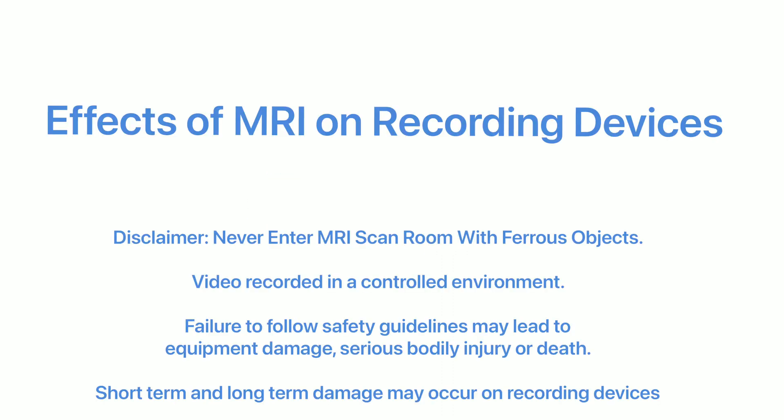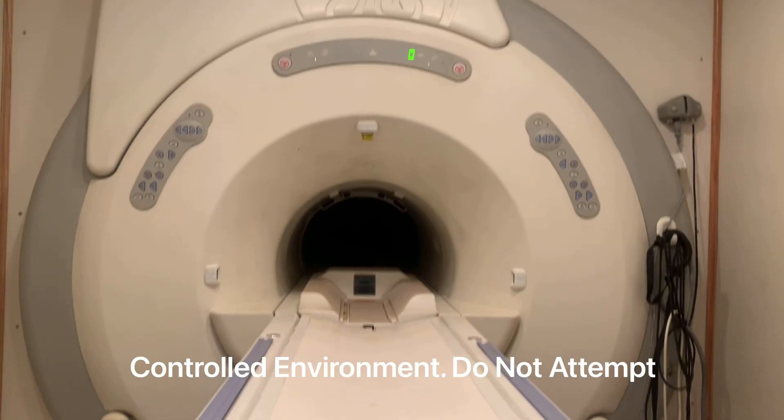This video will highlight the effects of an MRI on a camera. Here we have a GE 1.5 Tesla Mobile MRI Scanner.